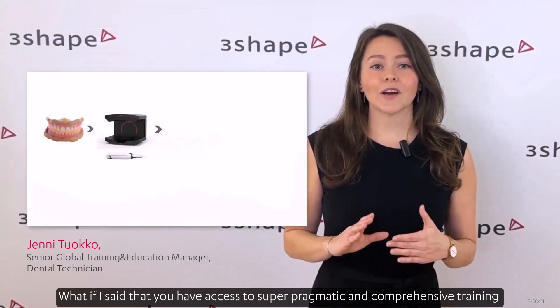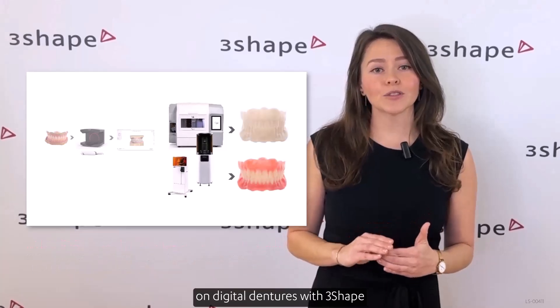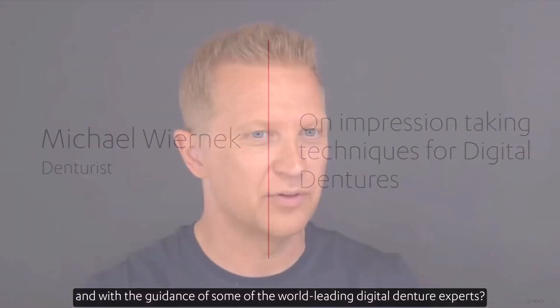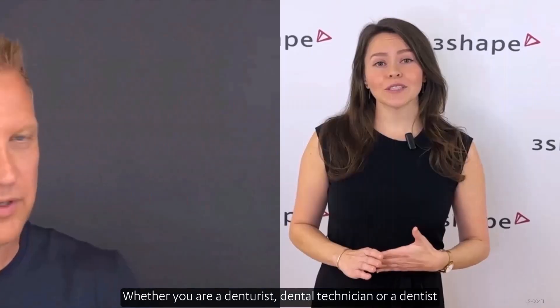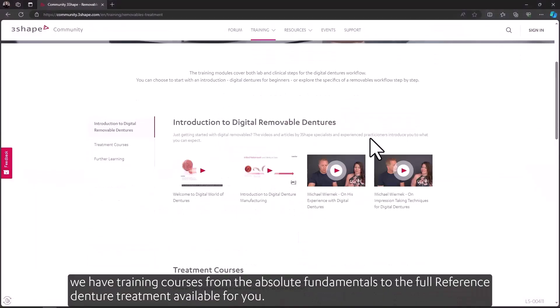What if you had access to super pragmatic and comprehensive training on digital dentures with 3shape, with the guidance of some of the world's leading digital denture experts? Whether you're a denturist, dental technician, or a dentist interested in learning about or becoming proficient in digital dentures, we have training courses from the absolute fundamentals to the full reference denture treatment.